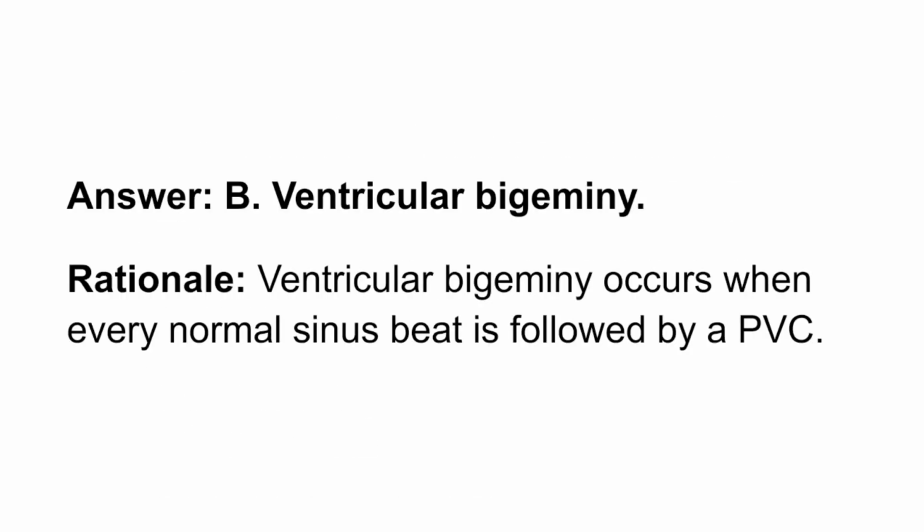Ventricular bigeminy. Rationale: ventricular bigeminy occurs when every normal sinus beat is followed by a PVC.